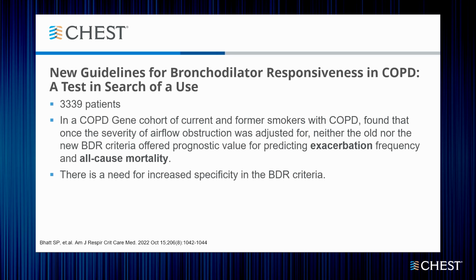Bhatt et al., who published this last year, showed that among 3,339 patients, it did not have a prognostic value in predicting exacerbation frequency and all-cause mortality. This was using the new ERS/ATS definitions. So they said there's a need for increased specificity in the bronchodilator response group.